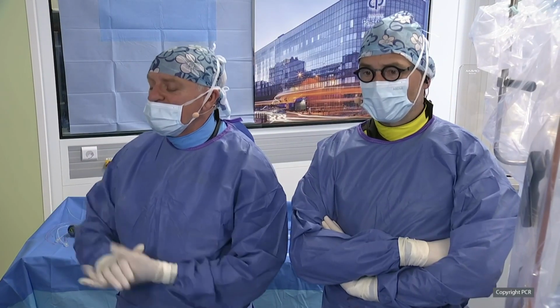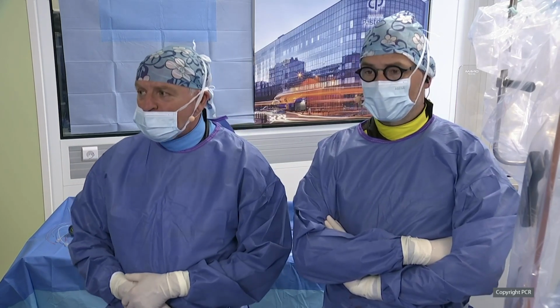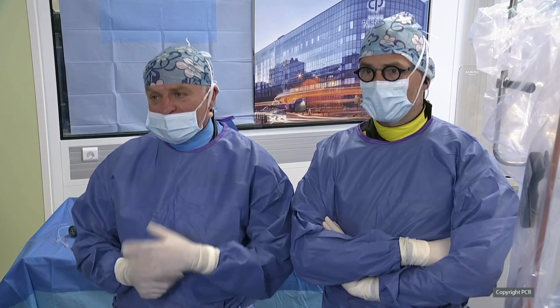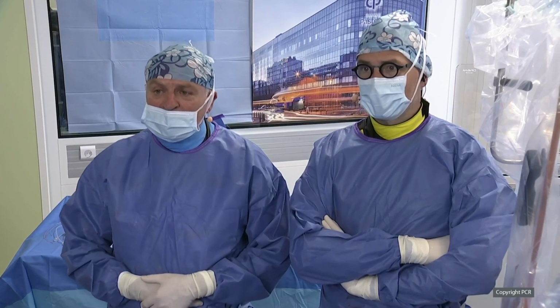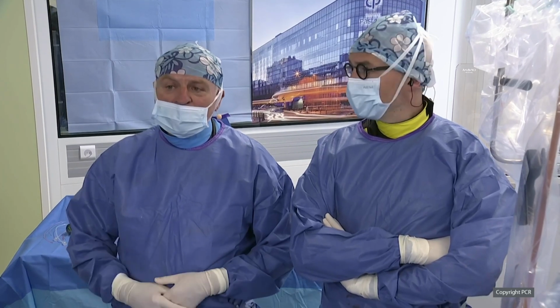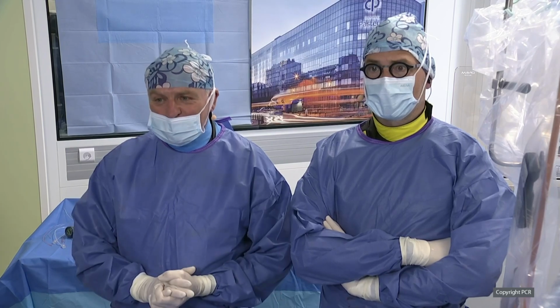And finally, we had the benefit and the advantage of Professor Yoshinobu commenting with the OCT, and you reviewed with him the important criteria we need to achieve so that the procedure will be safe for the patient. I'm quite sure we were not in the room that you have seen very nice MSCT images, and you are ready now to discuss the future of MSCT.